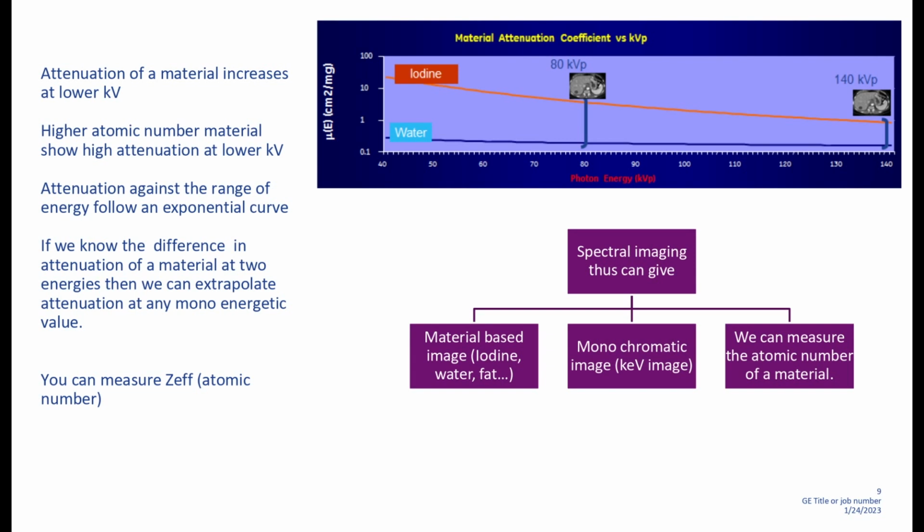If you want to quantify, then you have to go for iodine images and put an ROI. That is more accurate than your HU values. No, just on that image. What we want to see is how much the contrast has increased, how much the attenuation has increased. What is the baseline HU on your NCCT? Do you want to measure on HUs only?